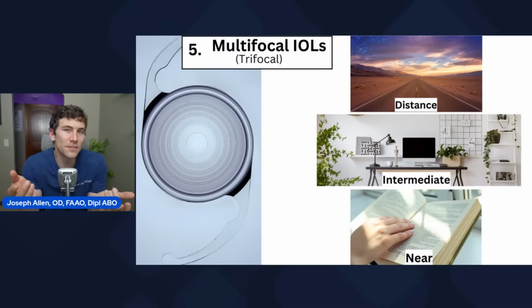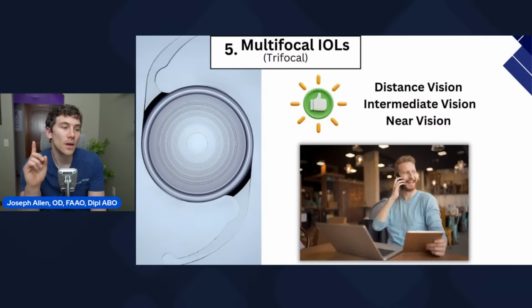It sounds a little confusing, but most people naturally gravitate toward this lens and have excellent vision afterward. And I think that's, again, why so many surgeons are preferring this type of new multifocal or trifocal lens. So this gives you that great distance vision, great intermediate, and great near vision. So a lot of patients who get these types of multifocals don't have to rely on glasses as often.